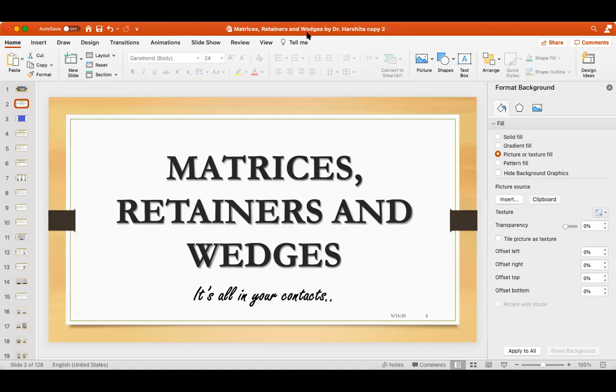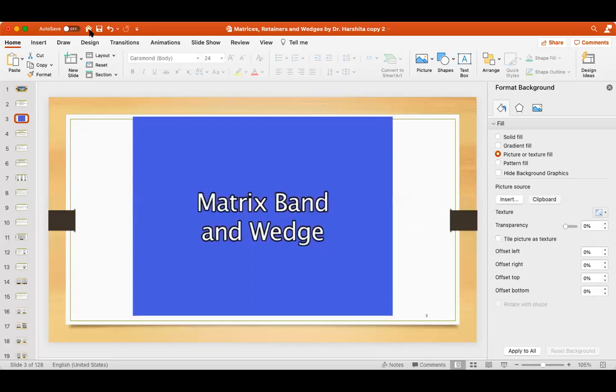So first, when you walk in the department, we'll start with your preclinicals, right? We'll ask you to create class 1 cavities, class 2 cavities on plaster models, and then we'll introduce you to bases, right? That's how it goes. The only thing we will be asking you is the fundamentals. And when you step to class 2 cavities, what exactly are we going to ask you? I showed you this video where you created a class 2 cavity and then you started placing your band, your wedge, whatever.